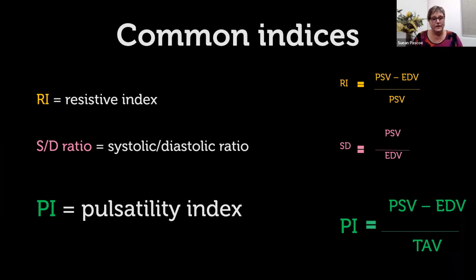So in the normal fetus, the resistance to flow, or the impedance, decreases in the umbilical artery because of increased numbers of stem villi as the placenta matures. All of these measurements serve as a surrogate marker for the well-being of the fetus. And by assessing the impedance within the fetal placental circulation, it's an indirect measurement of that resistance to flow in the placental vasculature.